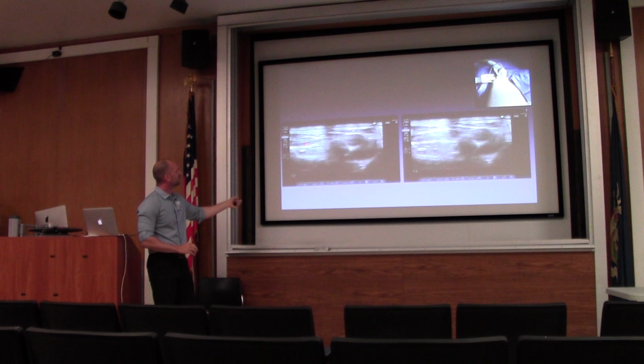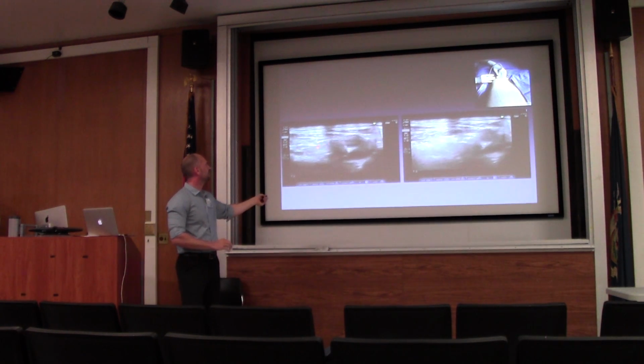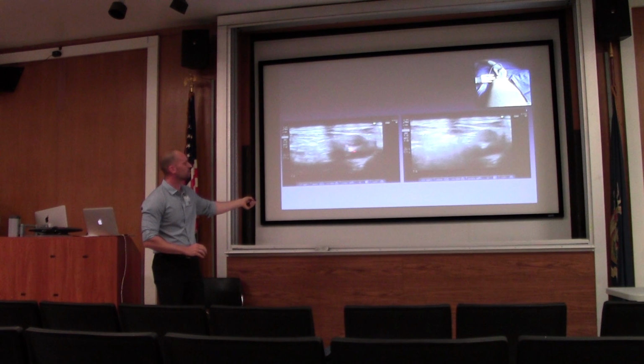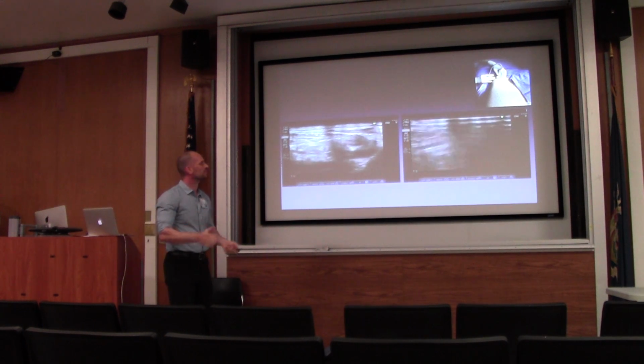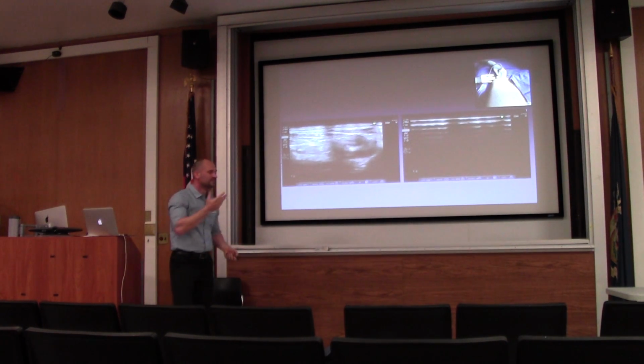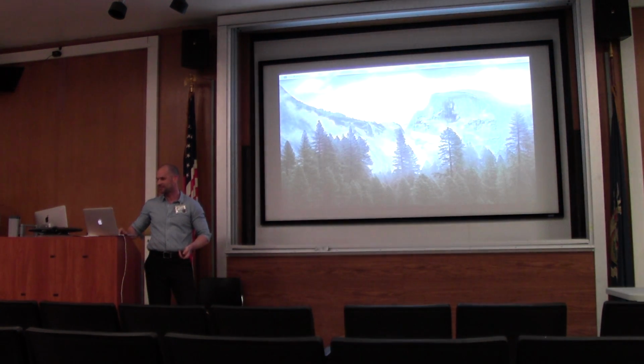What will happen is you'll see this dissection go proximally, but you also want to see it go medially. Excuse me, you'll see it go laterally, but then you also want to see it go medially as well, because that'll give you the innervation of your femoral nerve. And by that fact, it'll be allowed to go proximally and innervate your obturator. Now, I understand that these are pretty bad images, so there's a better one on YouTube, of course. So anyway, this is essentially what just happened.